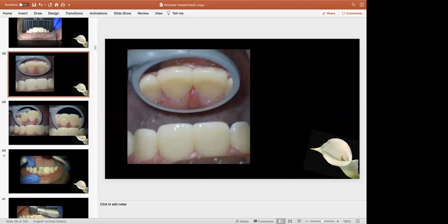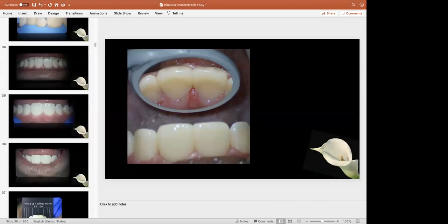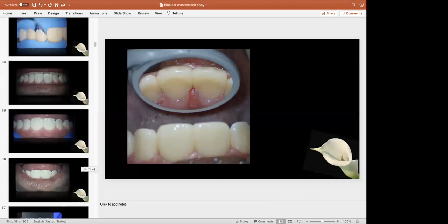Yeah, that makes a lot of sense. So people always ask, when do I cure the adhesive? It's a really simple question. Ask yourself this: do you have freshly cut dentin tubules anywhere near the pulp? If the answer is yes, then you will need to cure the adhesive over the dentin after massaging for 20 seconds, air thin and cure, and then you injection mold. And then you repeat the adhesive as a surfactant.